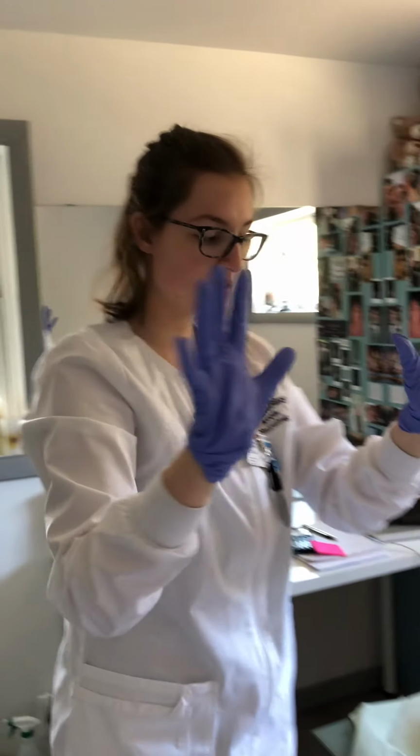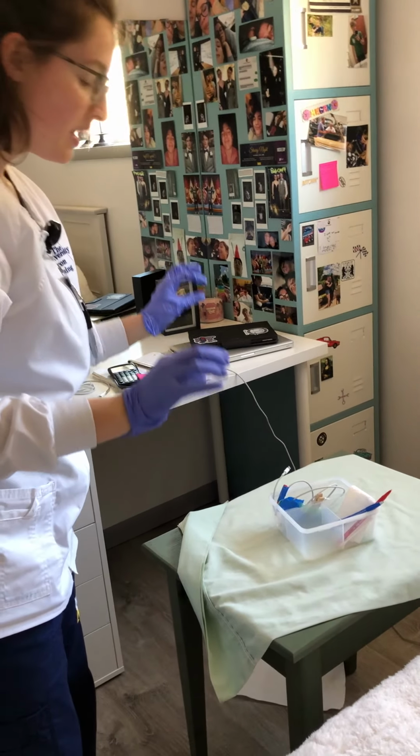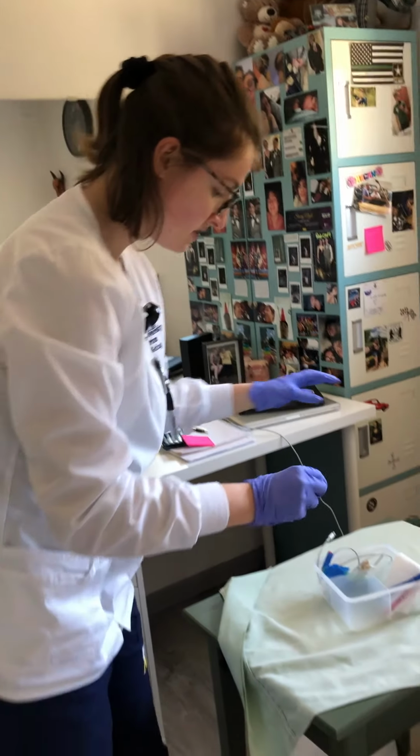Okay, so now we have sterile gloves on. I can go ahead and discard that. And then what I'm going to do next is pick up the sterile field and place it between the patient's thighs. Okay.